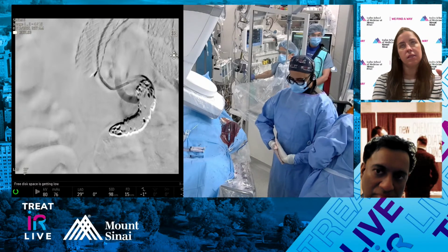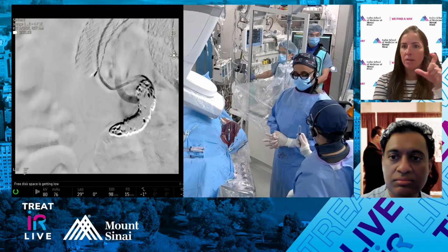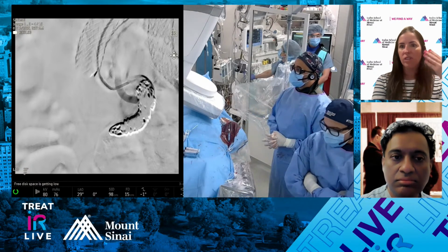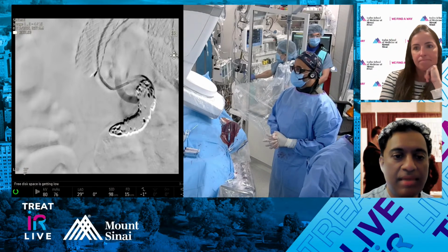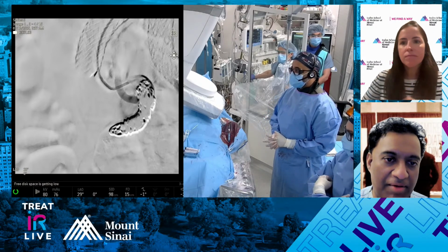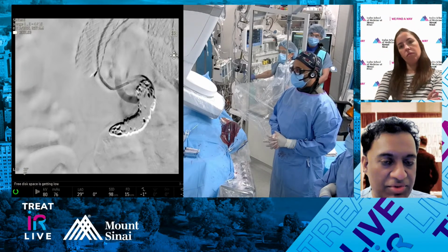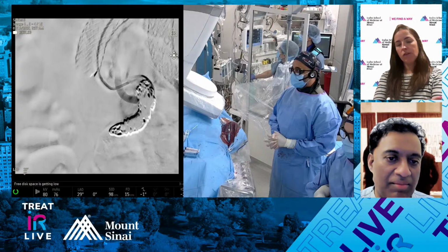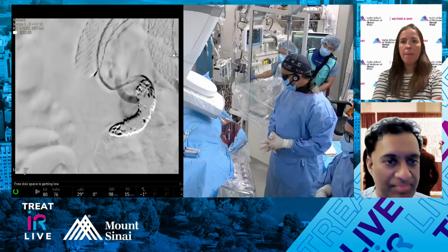And then I know we've been discussing this, and I just want to take a little step back for the people who are watching. We're talking about adding coils, where to coil to. Just tell us, what's safe, what's our stopping point, how distal can we start? I think the divisions are a great starting point, right above the bifurcation. And putting that pod was a wise idea. The pod or high radial force coil there worked out beautifully, right? And then you pack pretty aggressively with the floppy component and the packing coil.